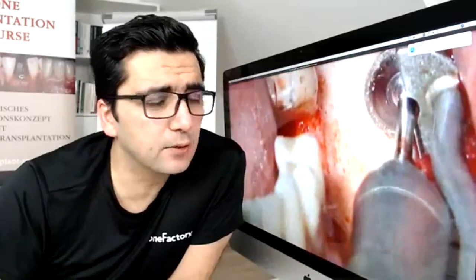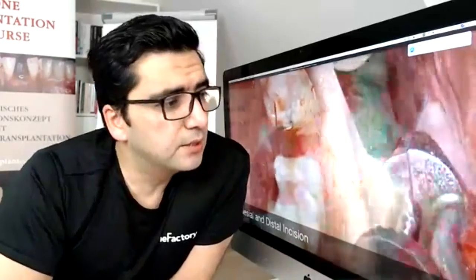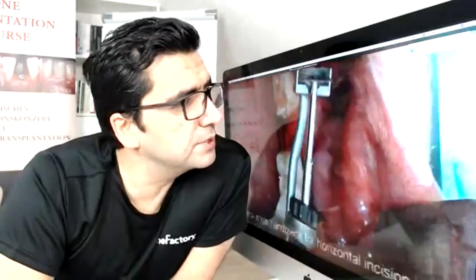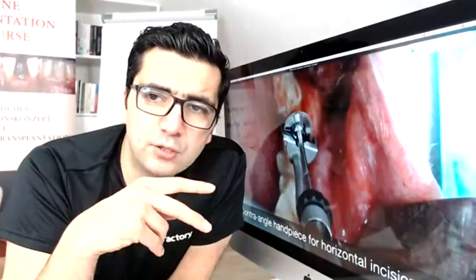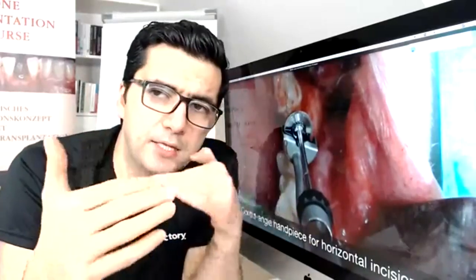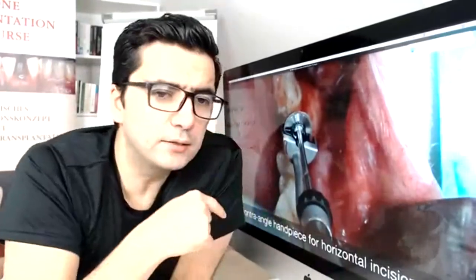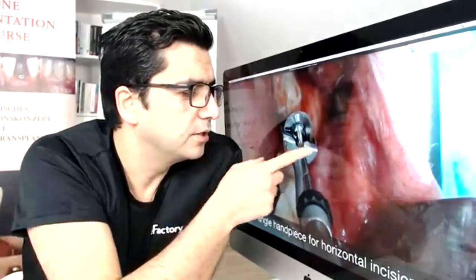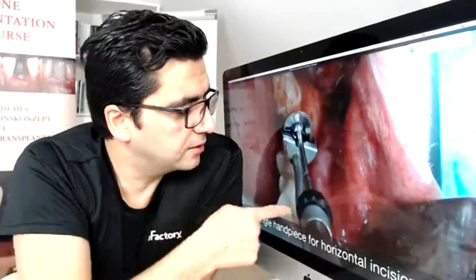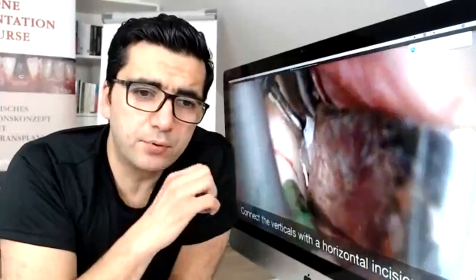The first step is to cut with a micro disc — a special disc. Two vertical incisions are created with a mini micro disc. After the two vertical incisions, we are in the retromolar area, around teeth seven and eight. Then we change to the contra-angle handpiece with soft tissue protection and water irrigation. The next step is to make the connection between the two vertical incisions.